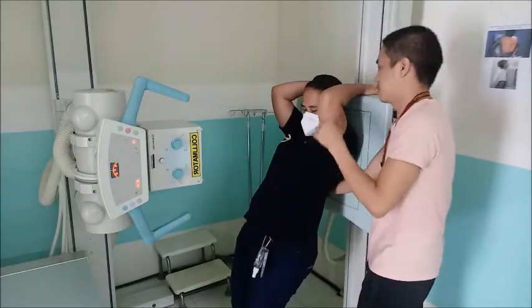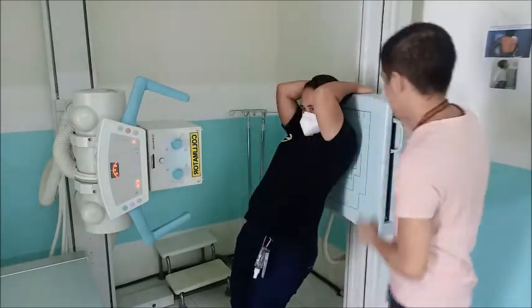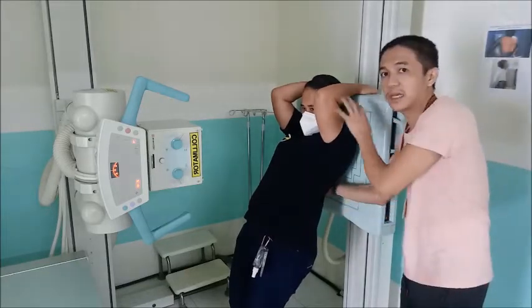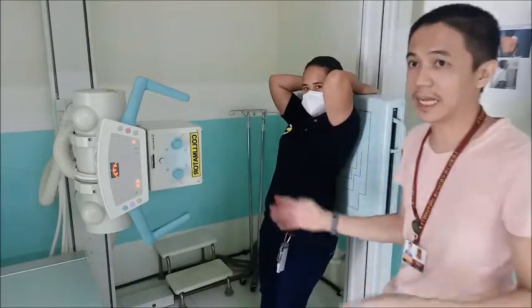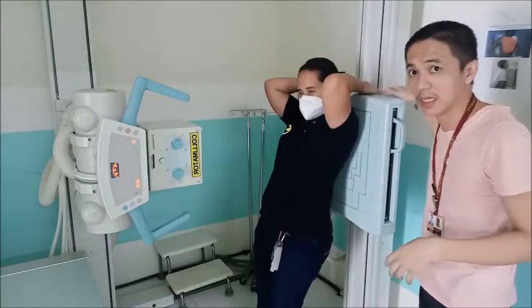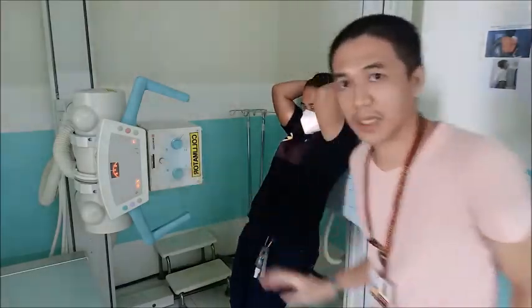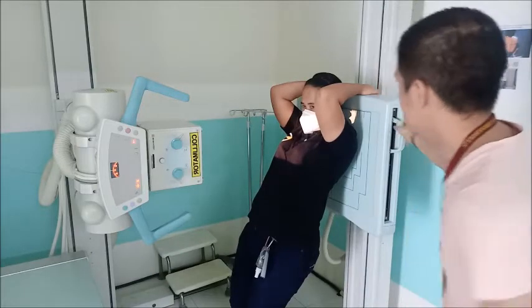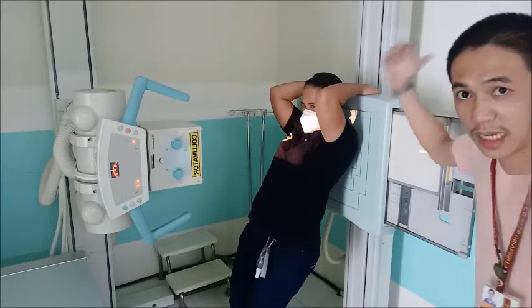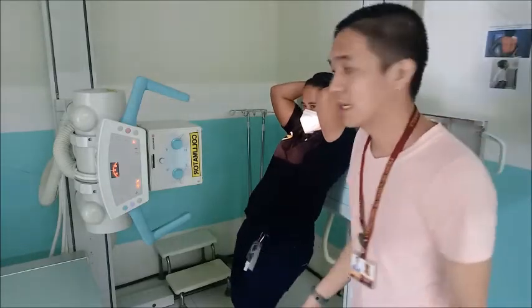Okay. So sa libro, di ba, dapat nakaana si patient, nakahawid sa iyang ulo. But then, because medyo slide ang atuang chest bucky, in the clinical setting, dili nato siya ginapaana, kaya medyo delikado. So munang gabuhaton ni mong pili ka, gahawid siya direct sa atuang chest stand. The problem karon is dili na nato makuha ang iyang lungs. Taas kayong IR. Dili na to pwede paubos ang chestan kay nakahawig si patient. Kung imo na ipaubos na ma-slide kayo si patient.